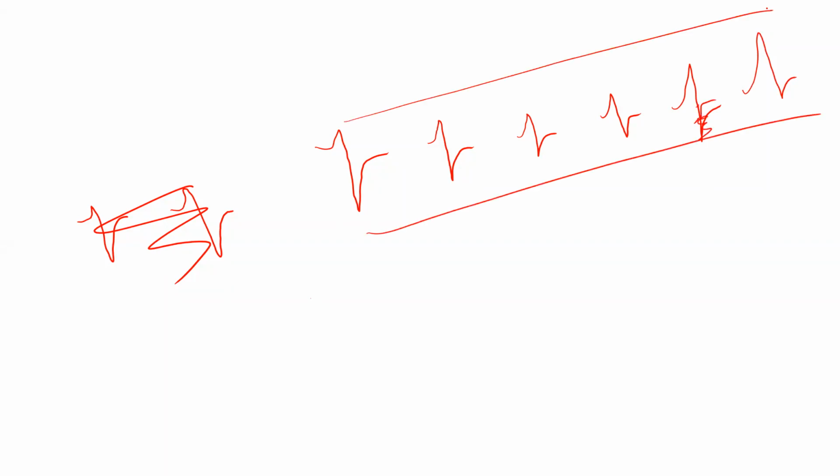So, this was a bigger negative wave, then slowly less, then less. Then bigger, and like this it goes. It's not that deep, small here, okay? Like this, this was the axis which we had for normal, okay? Because this is also by LV, and because there is an infarction on the lateral side, this also will be small.